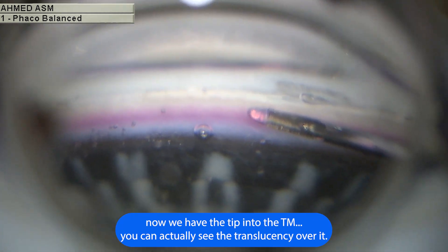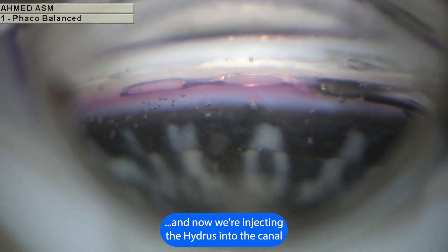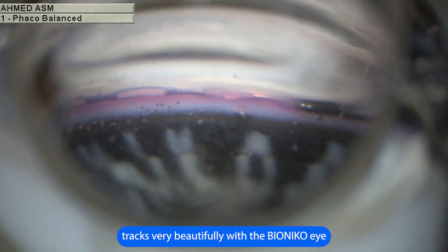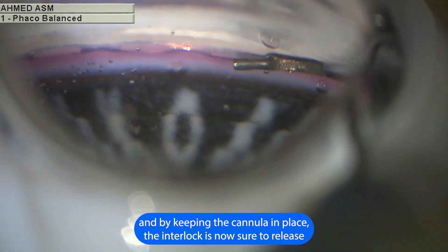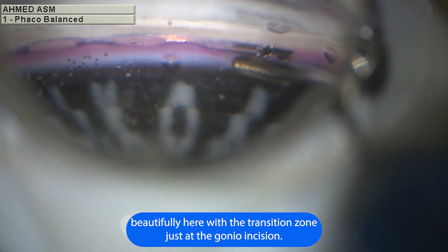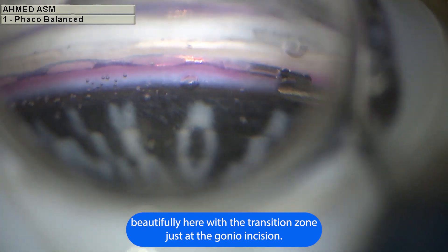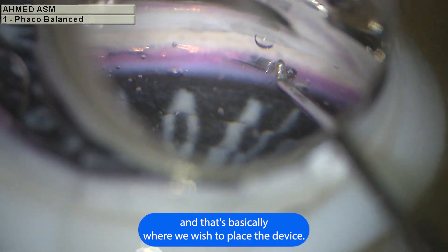You can actually see the translucency over it — just the tip — and now we're injecting the Hydrus into the canal. It tracks very beautifully with the BIONIKO eye, and by keeping the cannula in place the interlock is now shown to release the inlet, positioned beautifully here with the transition zone just at the gonio incision, which is basically where we wish to place the device.